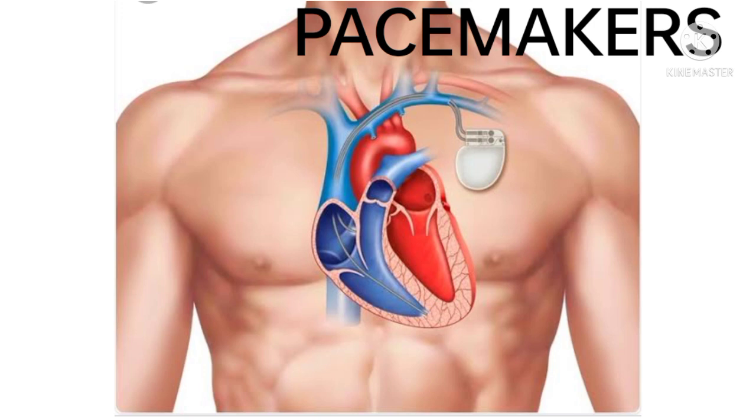Working of pacemaker: a pacemaker consists of a battery, a computerized generator, and wires with sensors at their tips called electrodes. The battery powers the generator, and both are surrounded by a thin metal box. The wires connect the generator to the heart. A pacemaker helps monitor and control the heartbeat. The electrodes detect the heart's electrical activity and send data through the wires to the computer in the generator. If the heart rhythm is abnormal, the computer will direct the generator to send electrical pulses to the heart. The pulses travel through the wires to reach the heart.